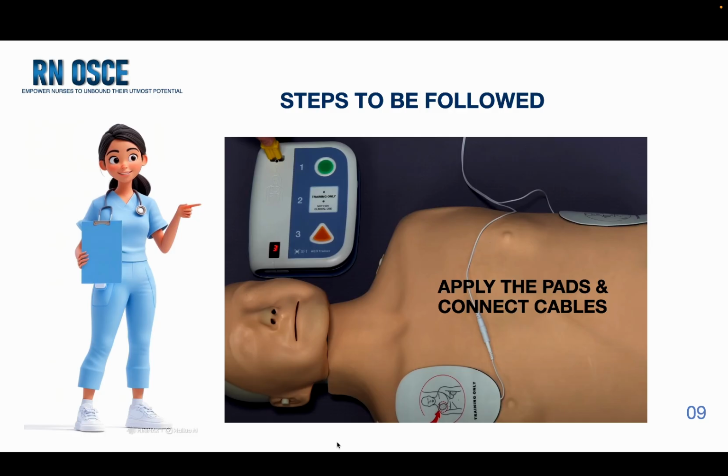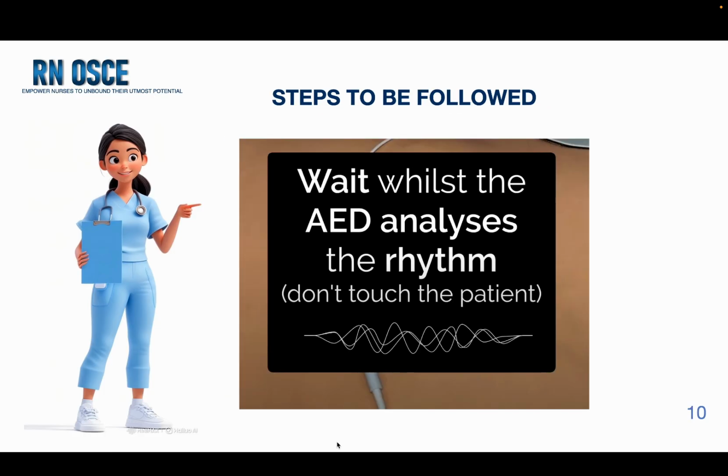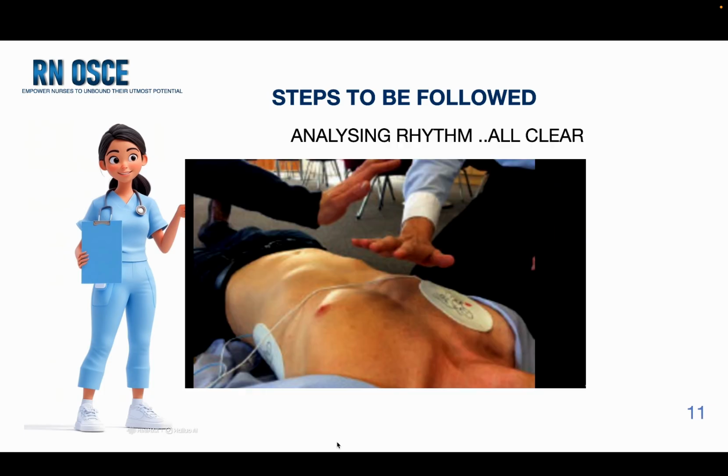Once the pads are attached and cables are connected, the AED will announce analyzing the rhythm. At this stage, stop the compression and do not touch the patient. You are supposed to verbalize all clear, analyzing the rhythm.